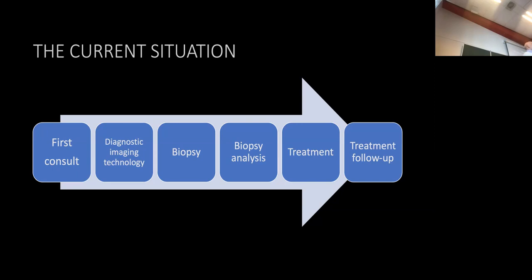And they can also, if they suspect something, start up a complete, what we call a workup or management of a disease. And usually this starts with asking if there is some additional imaging needed. Definitely in an oncological environment where you want to find out if something grows inside the human body, for example, something you don't want. And this diagnostic imaging technology could be CT, could be MRI, but most of the time it is endoscopy. Endoscopy is one of the broadest used imaging technologies in the clinic.